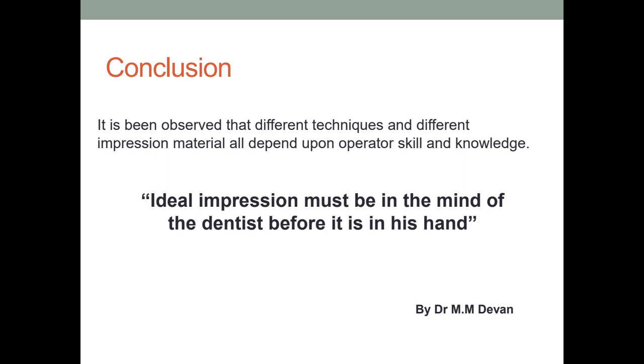To conclude my seminar, it has been observed that different techniques and different impression materials all depend upon the operator's skills and knowledge. It means that you are the one who is going to select the material. If you are using a material which is very expensive, very accurate, but you don't know how to use it, you don't have the knowledge, maybe your impression is not good. And if you're using a material which has limitations, but you know the limitations and you know how to manage them, you can make a good impression.